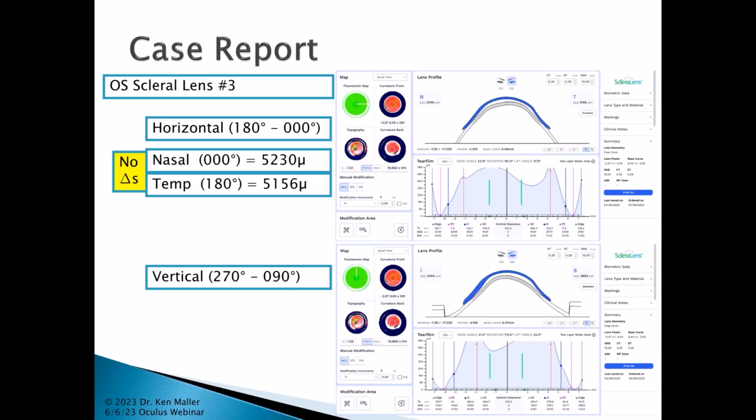Perfect. In these complicated cases, when you were doing those manual measurements of the sag height, what display were you using? How are you accessing that data?